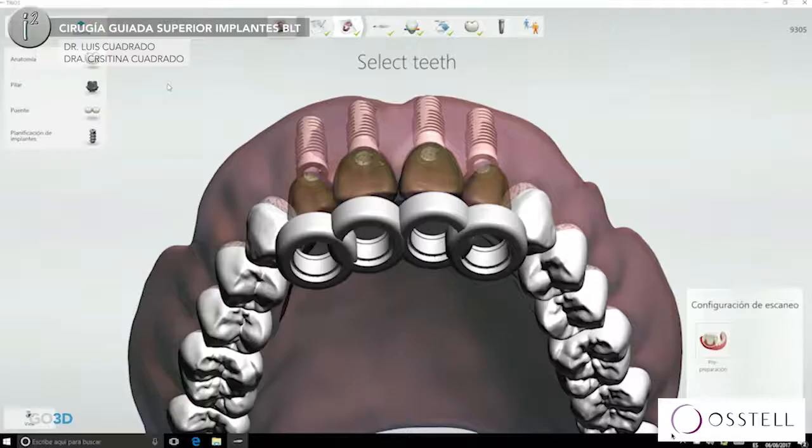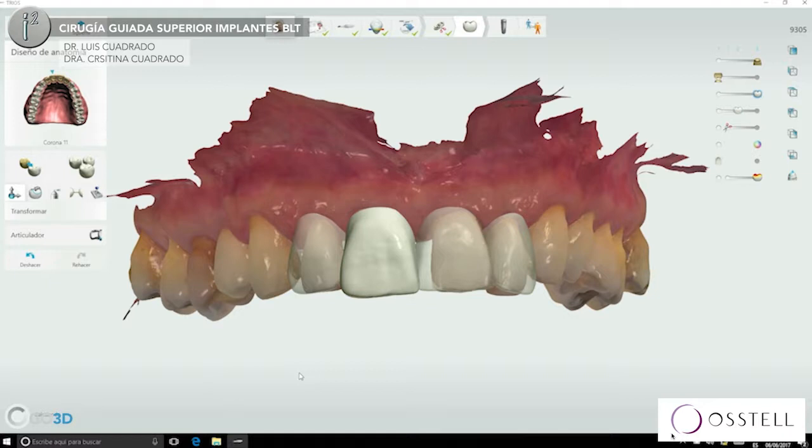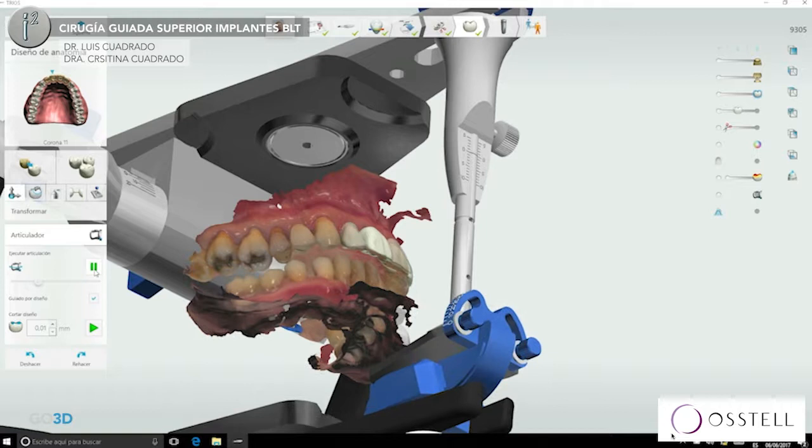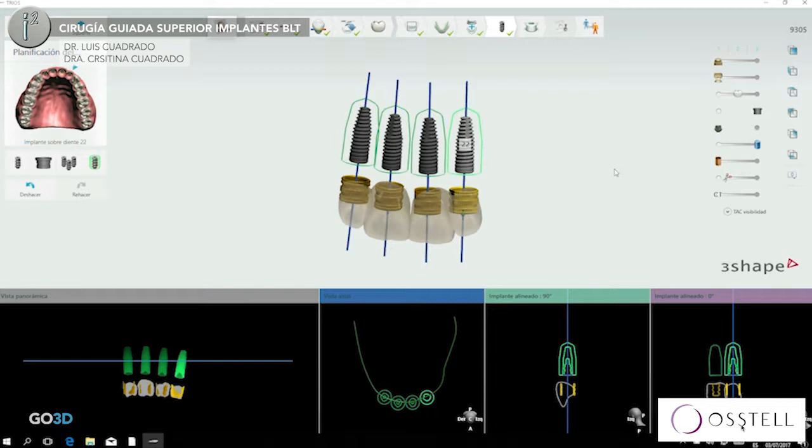This is guided with Implant Studio. In this case, we need to remove those four. We are planning it inside Implant Studio, CBCT. We are making a pre-design of the crowns, making everything, placing the implants virtually, taking care of the bone, of all the positions, everything. And now I have my four implants.